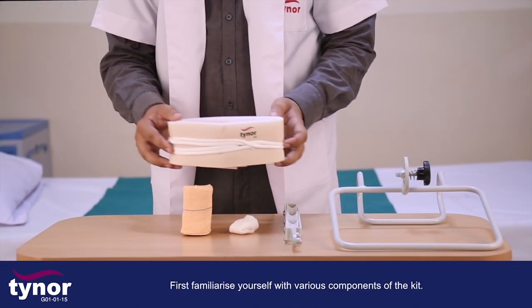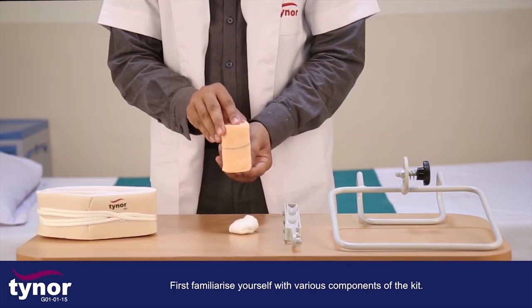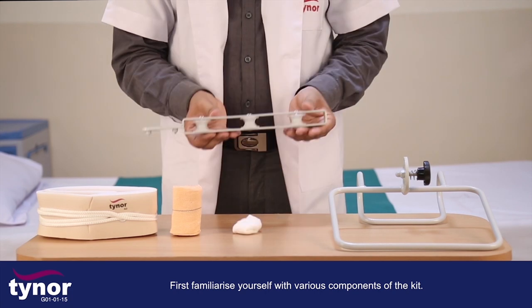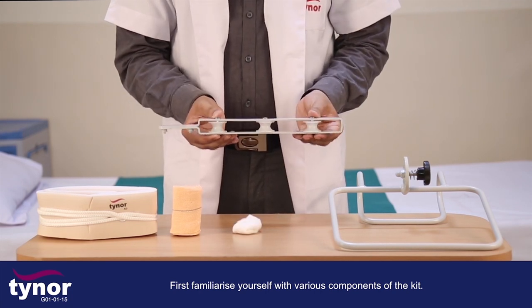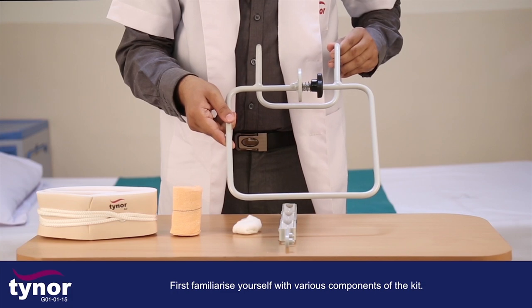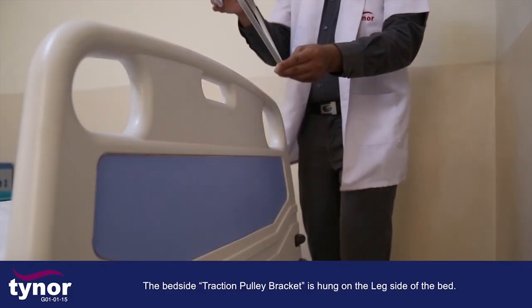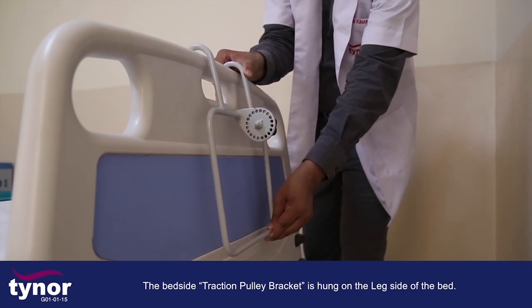First, familiarize yourself with the various components of the kit. The bedside traction pulley bracket is hung on the leg side of the bed.